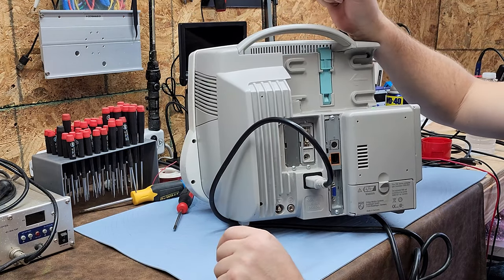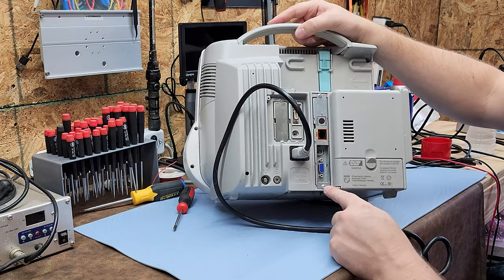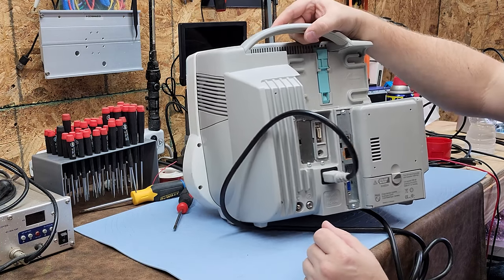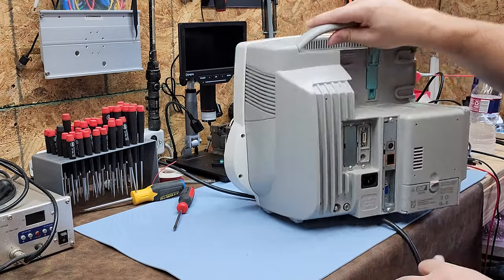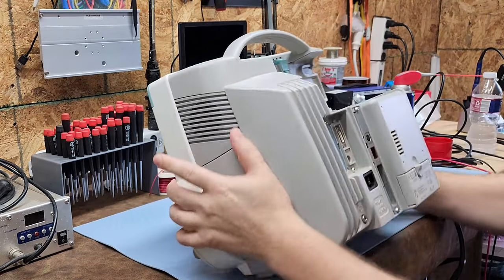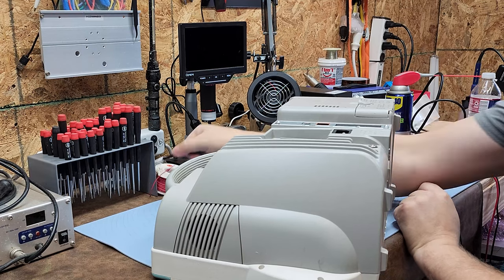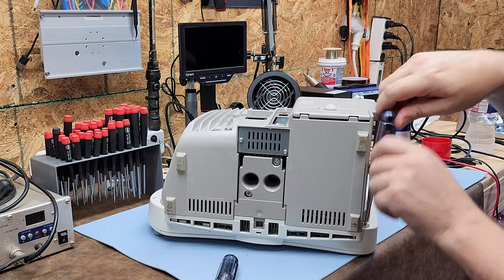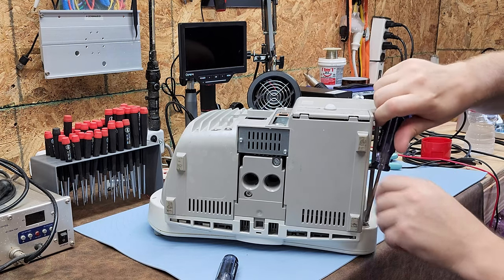Let's get into a teardown, explore the display — which we already know is defective — and maybe I can get you a part number and show you how to fix it. Philips loves using Torx fasteners, so I'm grabbing a Torx driver. First thing: unplug it. What are the odds — Philips does not use Phillips screws. Let's go ahead and separate the front panel from the back.